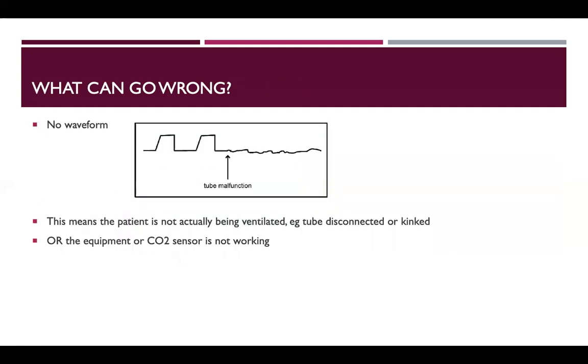So what could go wrong with this? Same thing. You can get no waveform at all. The patient could actually not be being ventilated, or the tube is disconnected, it's kinked, or the CO2 sensor isn't working. Those are all reasons to get a bad waveform.